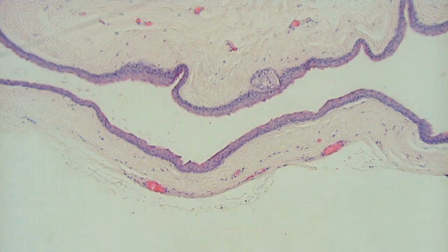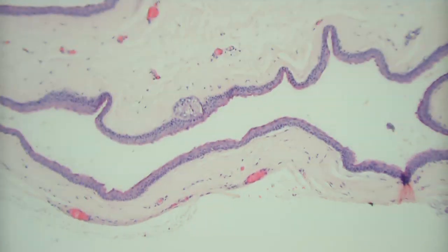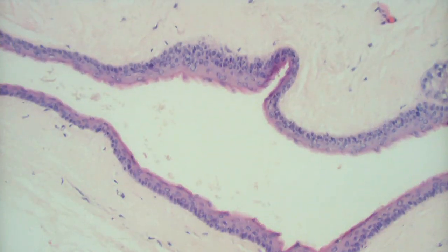Steatocystoma. Good. So why is it steatocystoma? There are two reasons. There's the obvious reason that third graders should know. What's the obvious reason that I'm pointing at right there? Well, there are sebaceous glands in the lining. So that's the one reason. But what's the other reason that this is a steatocystoma, the more resident-level reason?